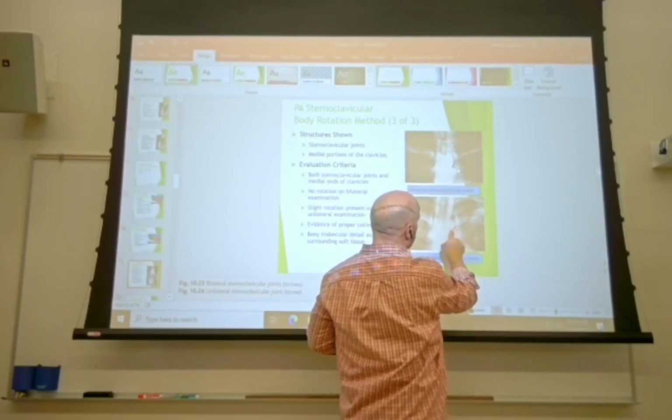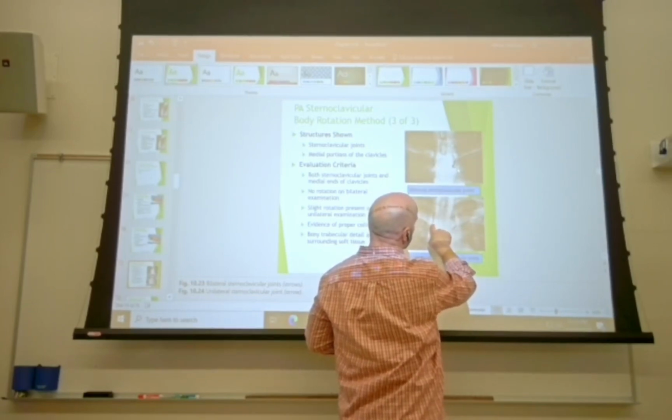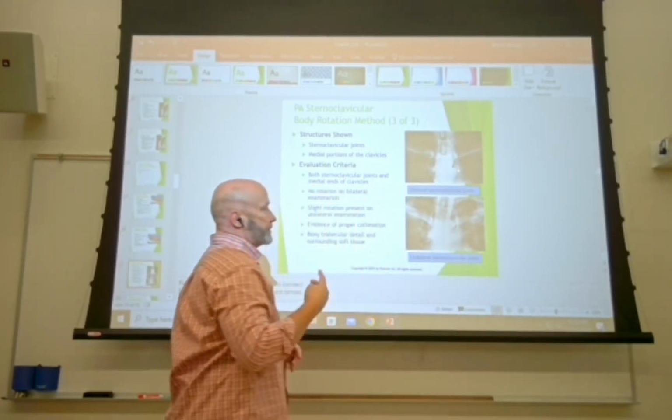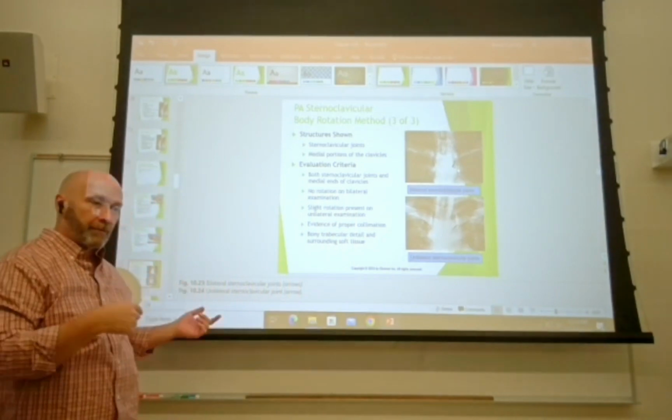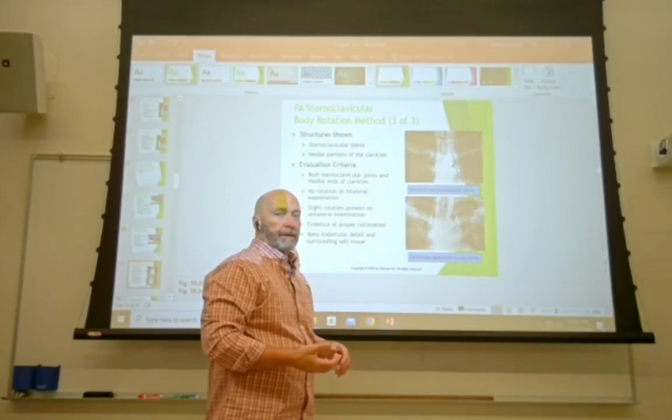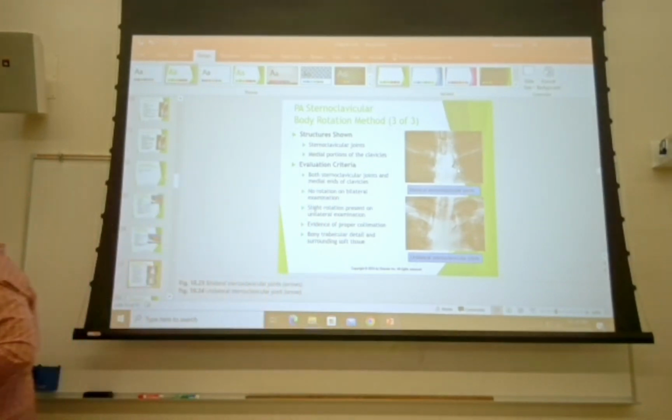So what we're seeing then is sternoclavicular joints. You can see it on the downside on that one. You can see it on both sides on both of those. But you're going to shoot both of them, look in one direction, look in the opposite direction. The other one truly is an oblique. Let me advance the slide.